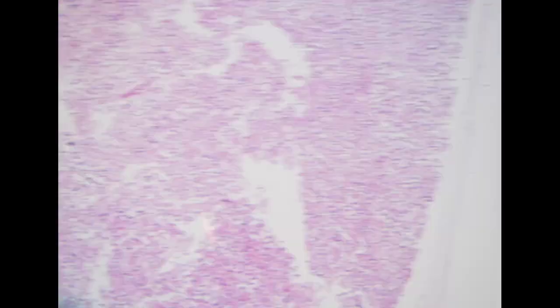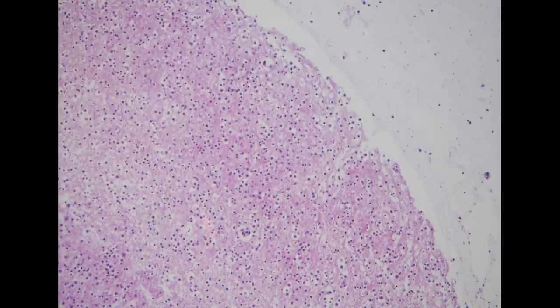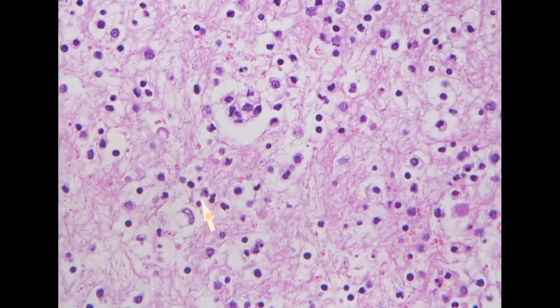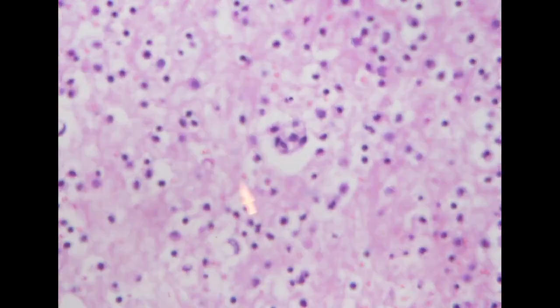So let's do an adenocarcinoma marker. We will do MOC31. I find that Claudin 4 usually stains much weaker than MOC31.